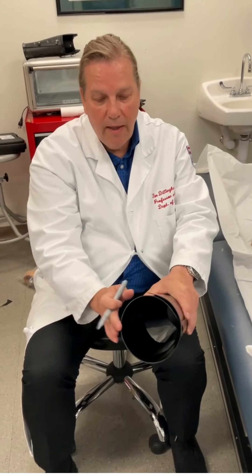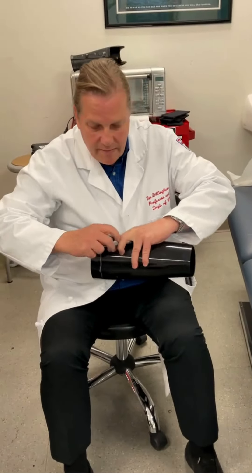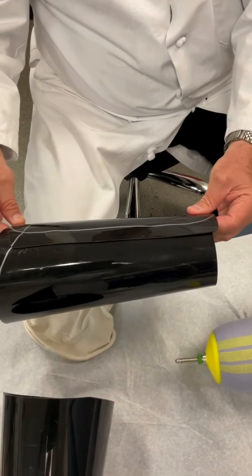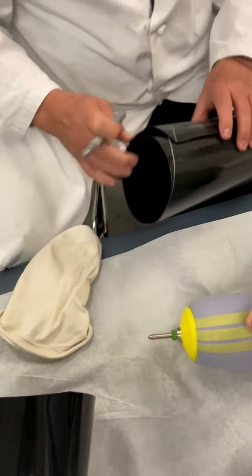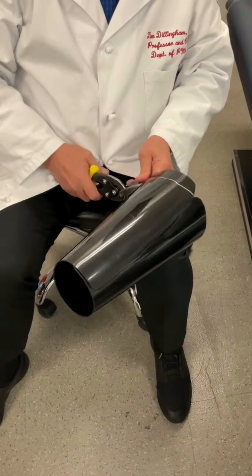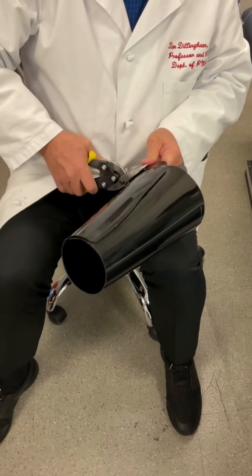So here would be the medial side of the leg, lateral side of the leg, and so this is the first set of cuts. I'm looking at this where to cut it. I'll do this first, then I'll do the big end length. So now we've cut the top rim.